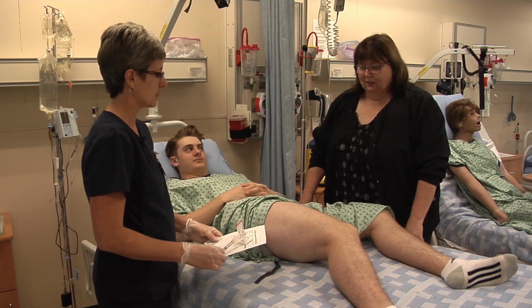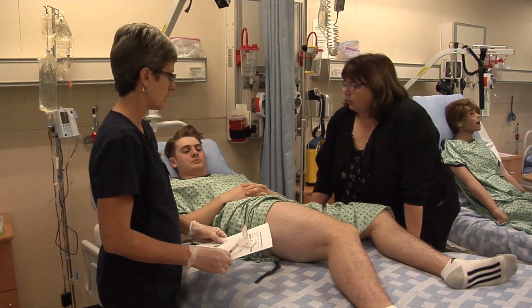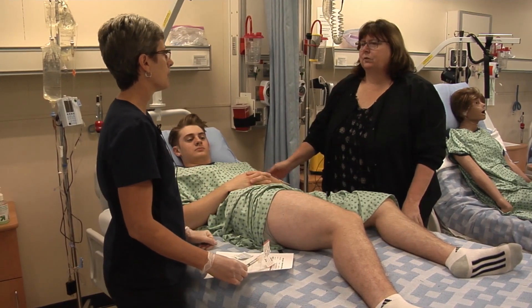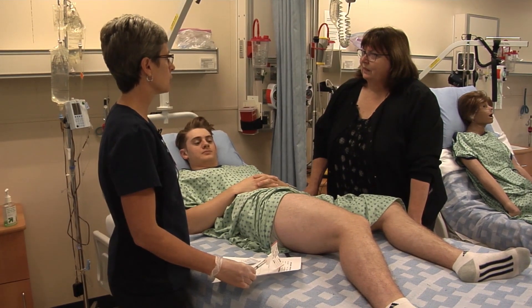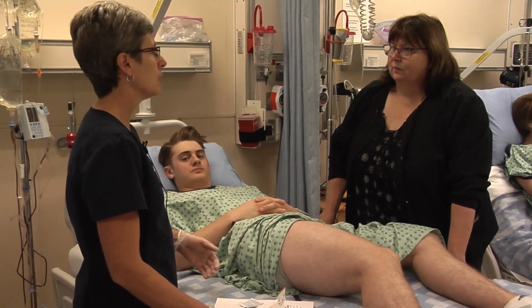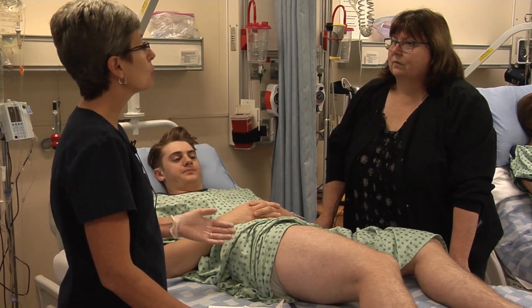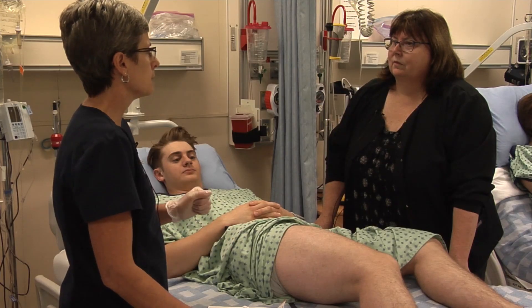So I am doing injections into the vastus lateralis, being a leg muscle. Why would we choose this and not the deltoid? If I need a larger volume, I can put a larger volume into the vastus lateralis generally, because the deltoid is limited to about two mils — up to two mils, although if somebody has a large muscle mass, you might decide to go for three. It's really up to the nurse to make that judgment every time they go to the bedside. You can have an adult that weighs 100 pounds and one that weighs 300 pounds, so you use that accordingly. You wouldn't put three mils of fluid into somebody with a little emaciated muscle.